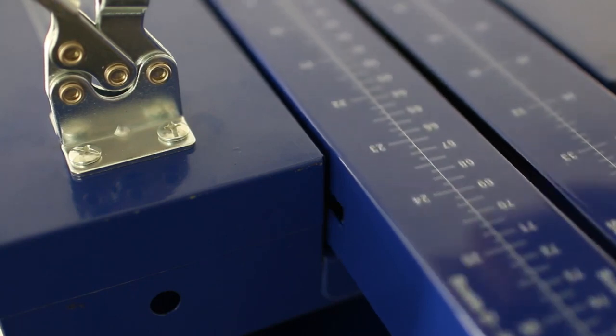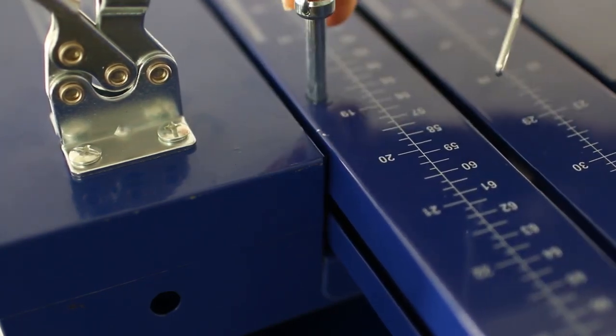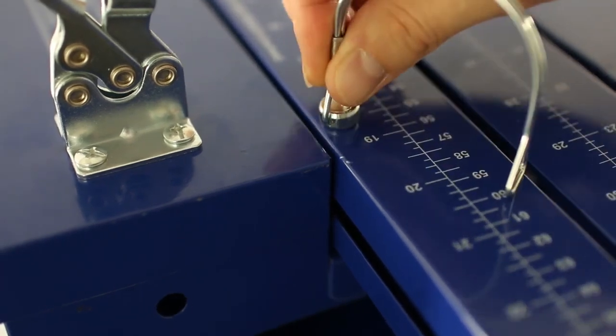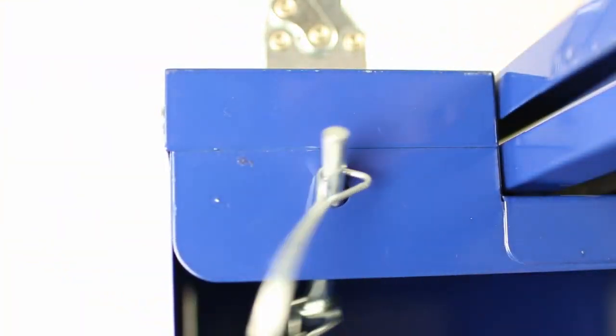Align the sliding top channel on the top plate so that the hole around number 18 on the sliding channel is on top of the hole on the top plate groove. Put the hitch pin through both holes and latch it closed. The hitch pin may be stored in the hole on the back side of the unit.